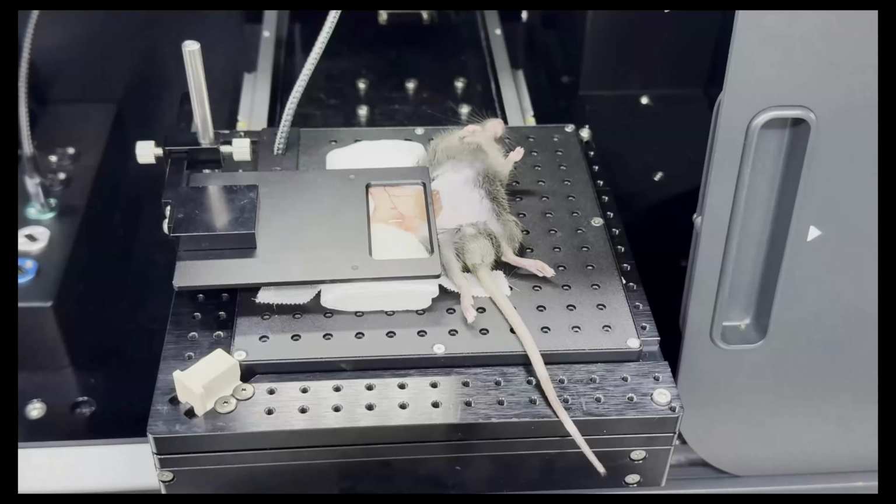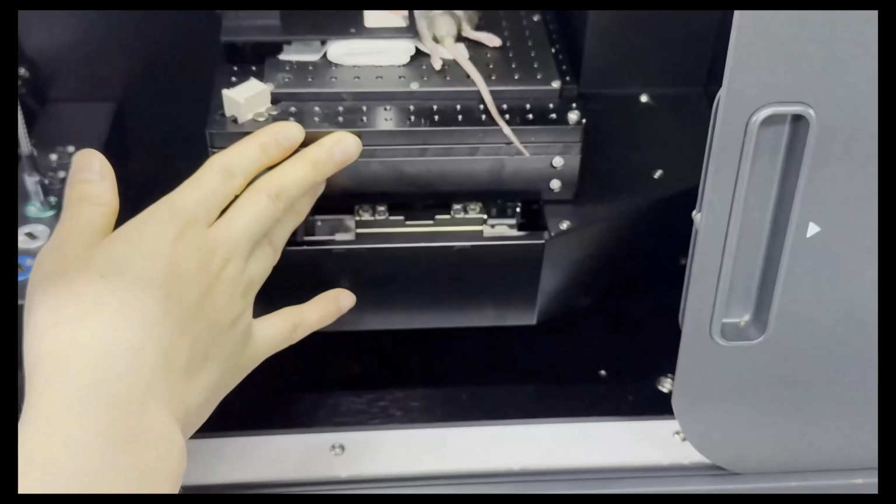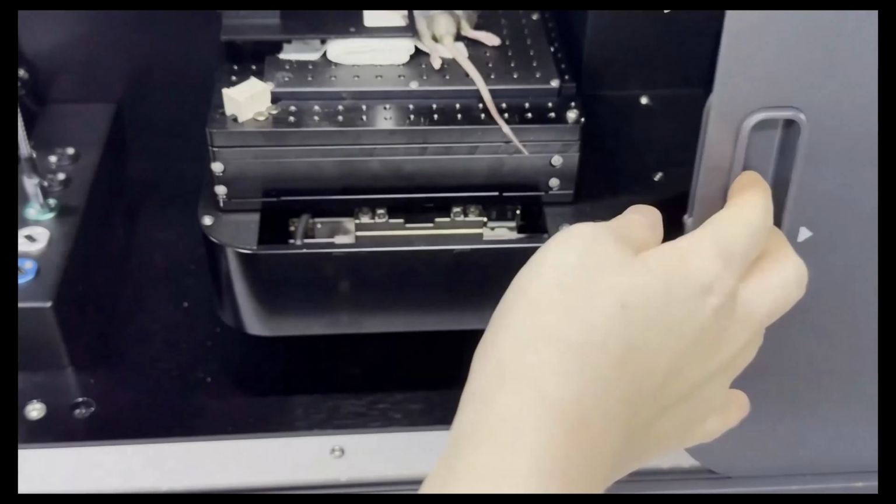I prepared this mouse for imaging the right inguinal lymph node by anesthetizing it, shaving the area, and then making an incision to expose the lymph node. Afterward, I placed a cover glass over the tissue to prevent it from drying and to match the refractive index required by the lens. And now I insert the stage into the chamber and close the door to start imaging.